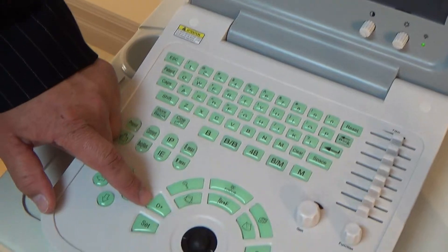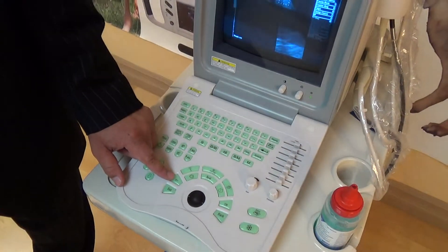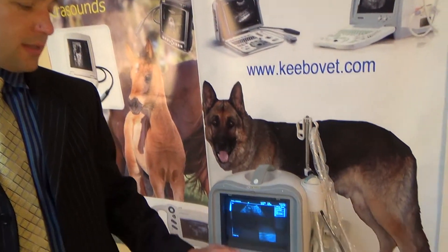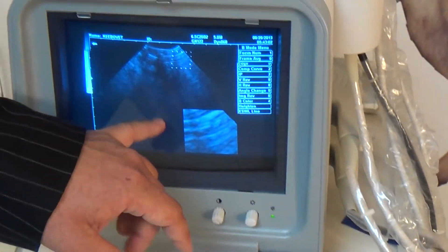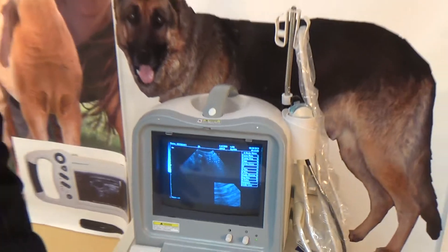Another button continuing along is the D+. This button is used when you're doing measurements, both for OB or for regular use. What it does is allow you to set the viewpoint — a starting and endpoint for straight lines or for ellipses — so you can get accurate measurements.